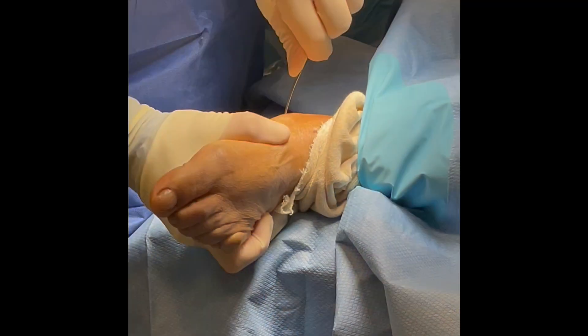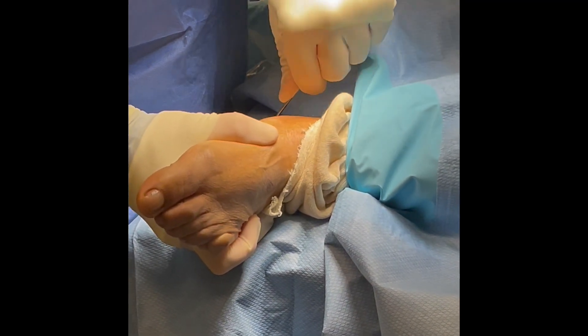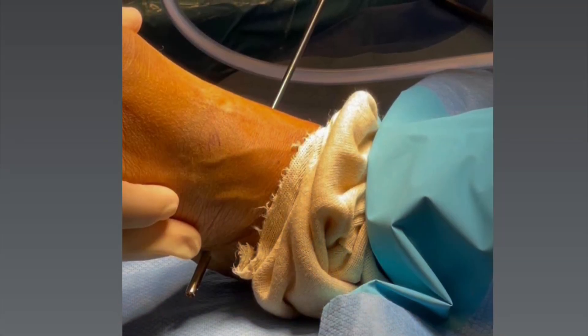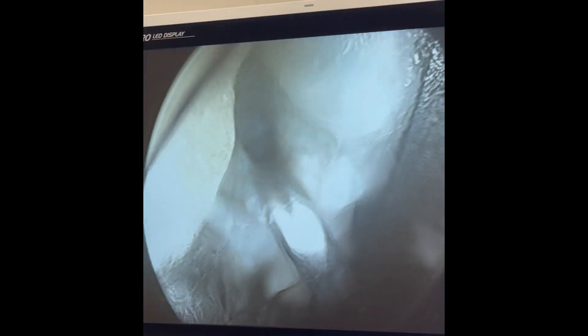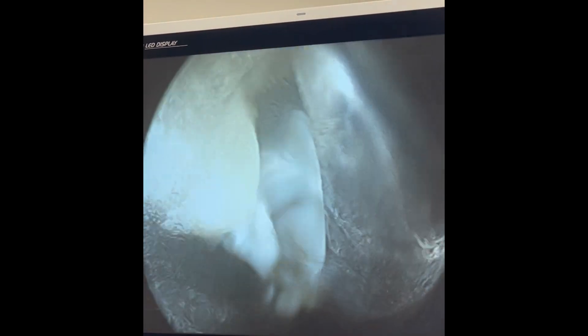The way we do this is basically through a camera — we make a small stab incision on the heel and pass a little cannula through the bottom of the heel that separates the fat pad from the plantar fascia. Through the camera, we're able to look and see the fascia. The fascia almost looks like a piece of lasagna — it's a very thick, fibrous band that inserts from the heel and extends into the ball of the foot. Then with a little hook blade, we're able to slide the hook blade across the plantar fascia and separate it.